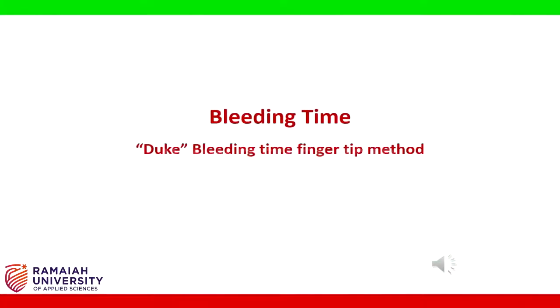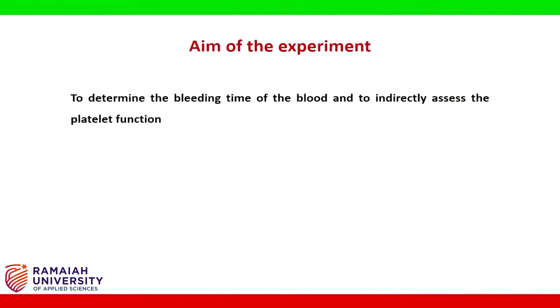Hi students, bleeding time, Duke's bleeding time fingertip method. Aim of the experiment: to determine the bleeding time of the blood and to indirectly assess the platelet function.